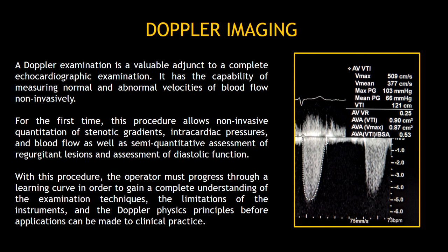With this procedure, the operator must progress through a learning curve in order to gain a complete understanding of the examination techniques, the limitations of the instruments, and the Doppler physics principles before applications can be made to clinical practice.